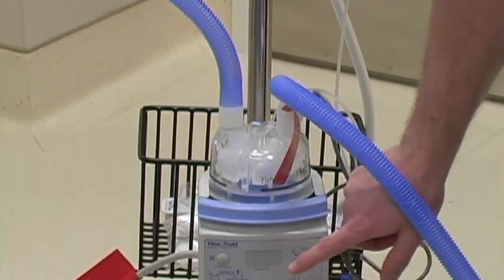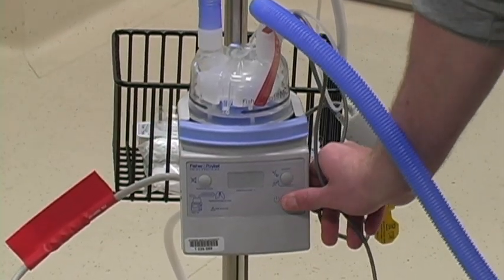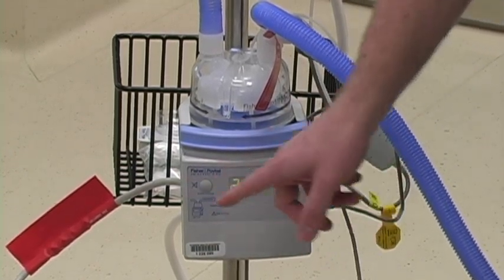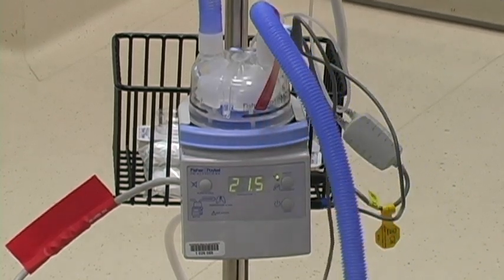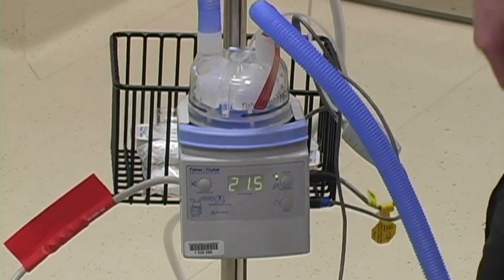And again, this is a basic heater. You have your on-off, which you just push the button and it fires up. The big one for you guys is a silence button. I know that's usually the first question. And then this is just a button to adjust temperature. Respiratory will take care of that for you. So I'll just turn it off for this demonstration.